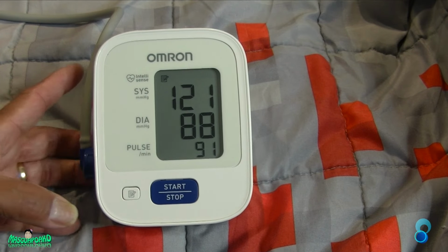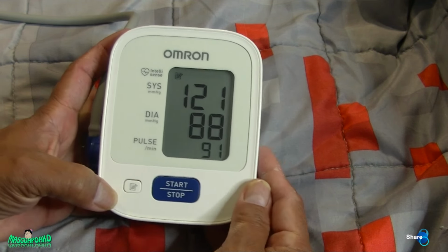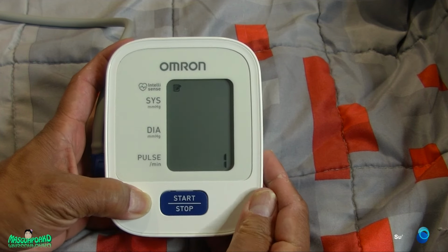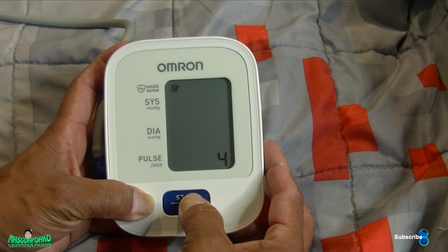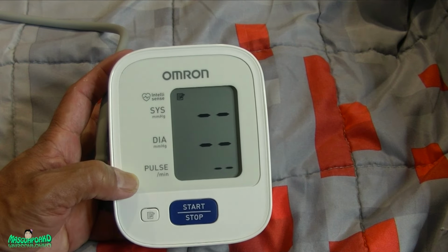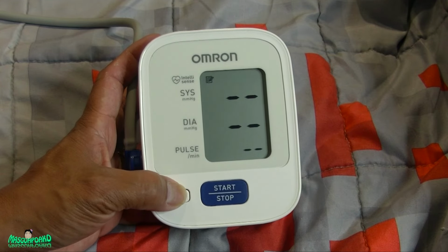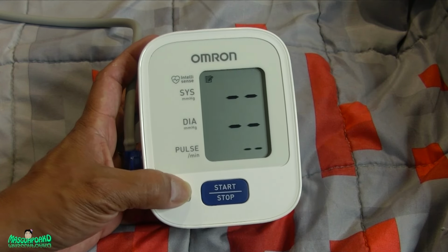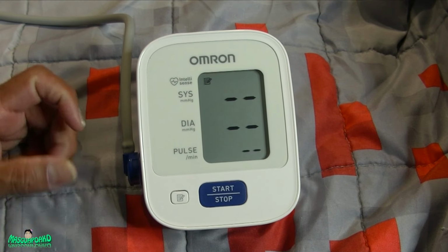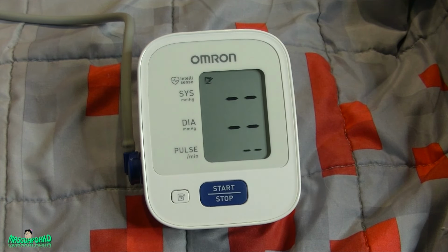And in order for you to delete it, you hold this button here, the memory, and this, start and stop, for 3 seconds. Now it's erased. Everything's erased. See, there's nothing stored in there now. Alright, so that's how you erase the memory of all your previous readings.